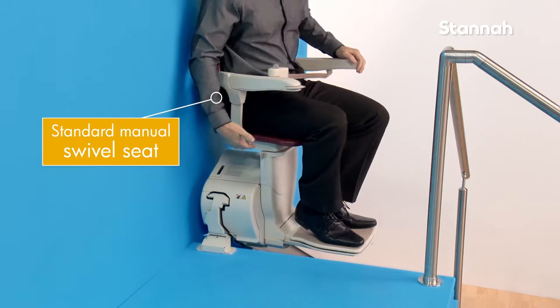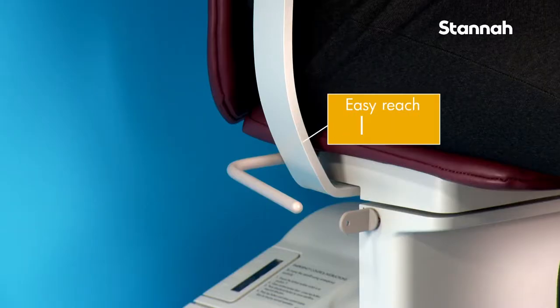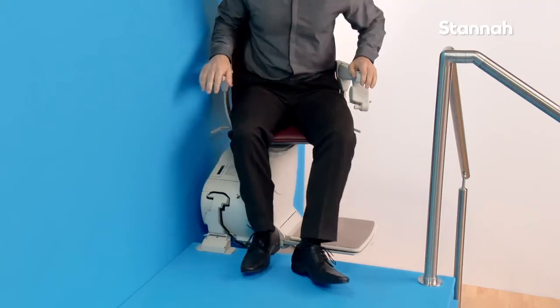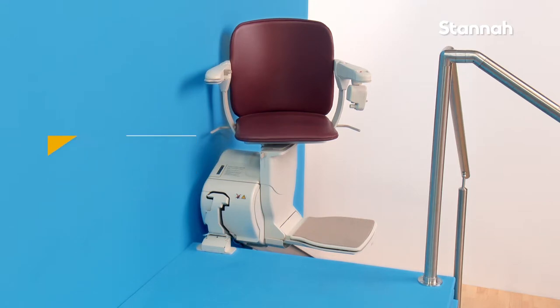The manual swivel seat is easy to use and requires minimal effort. It is operated by pulling up on the naturally positioned levers found on either side of the chair, so that you can use either arm for easy operation. This standard safety feature ensures that you feel safe and secure when getting off the stair lift at the top of the stairs.